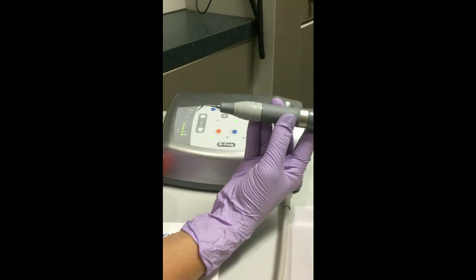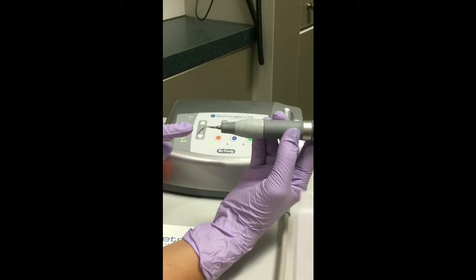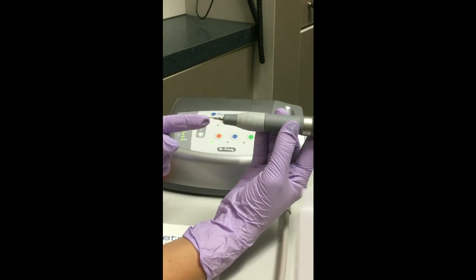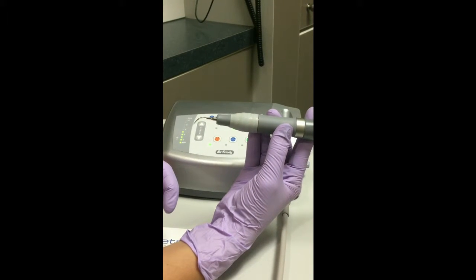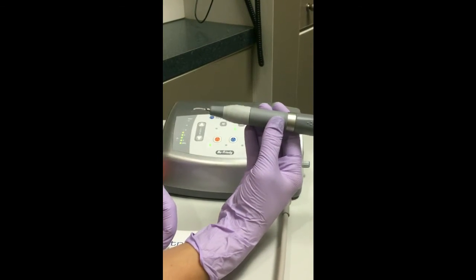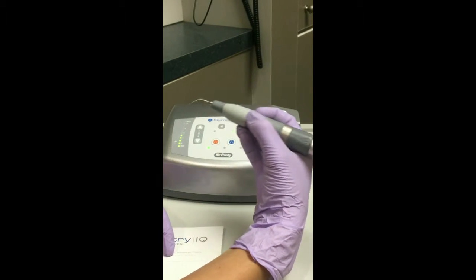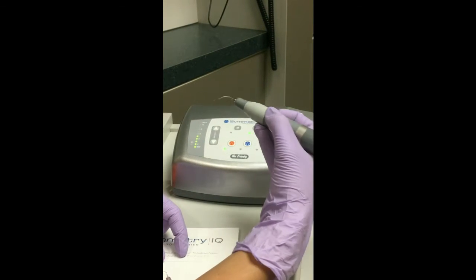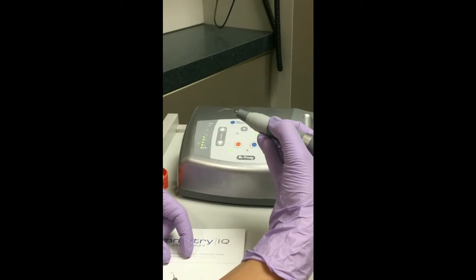Each tip moves in a linear motion forward and backward. Only the lateral surfaces of the tip are active; therefore, it is important to maintain proper adaptation of the lateral surface of the tip to the tooth. To accomplish this, pivoting the wrists around curvatures and line angles is a key technique to master. This technique is very similar to maintaining a proper working angle of a hand scaler.